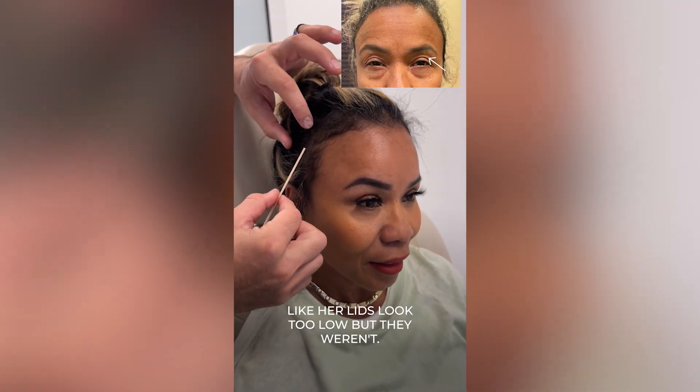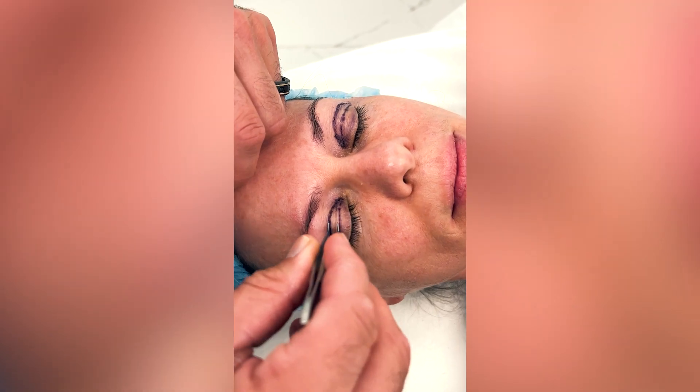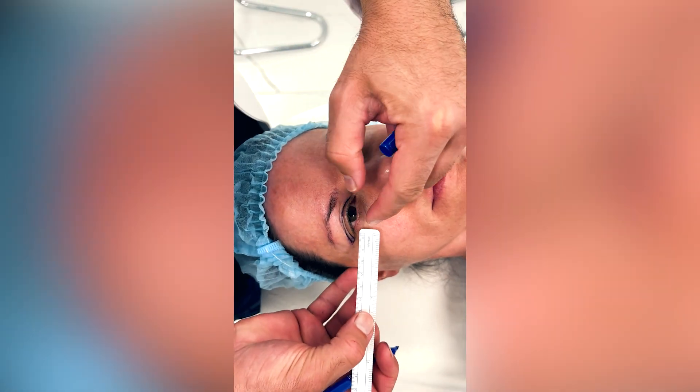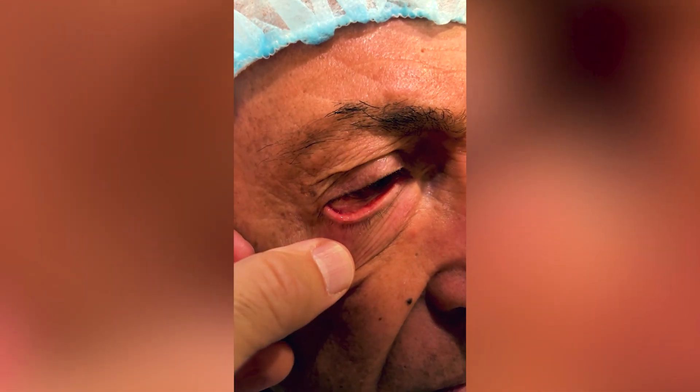You need to be familiar with equipment, love your equipment, and know what they can do, what they cannot do. When it comes to, let's say, an upper eyelid blepharoplasty, you see my videos how I mark the patient sitting up and sitting down. I adjust my marks, I use a pinch technique with some instruments to make sure the amount of skin I'm removing is adequate, and then I start.